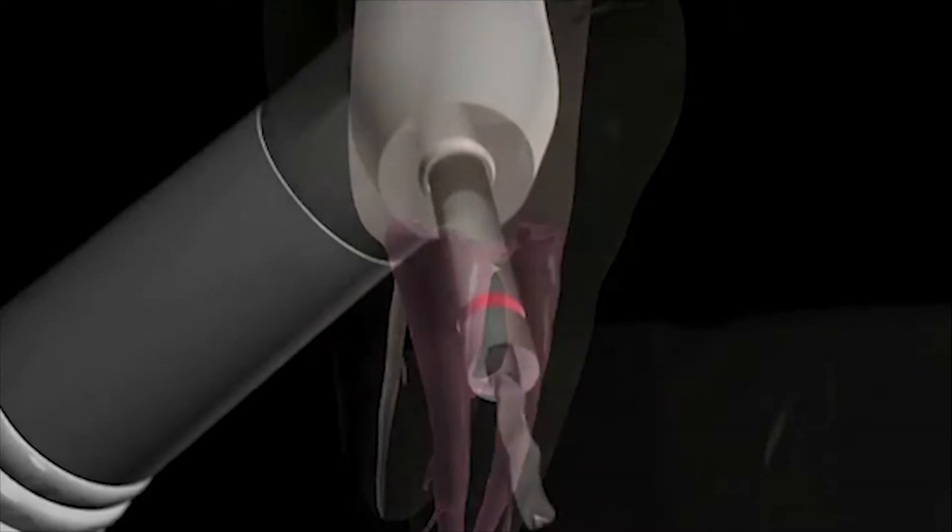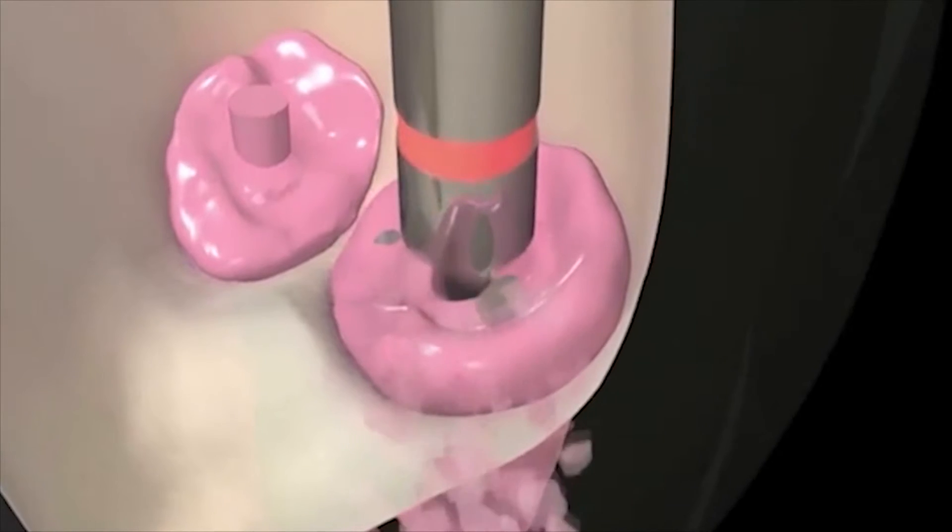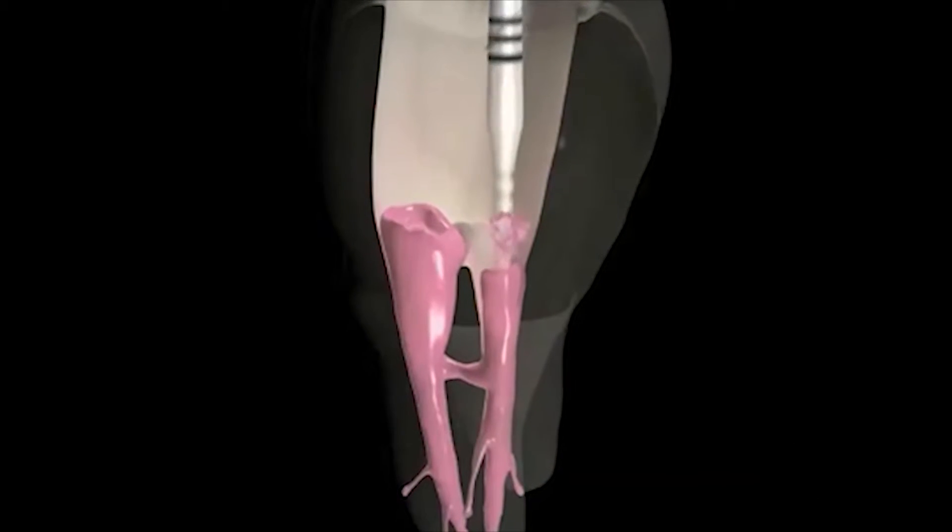GuttaCore obturators remove easily like gutta-percha because they are gutta-percha through and through. You'll see the familiar shredding characteristic, whether you're creating post-space or retreating.